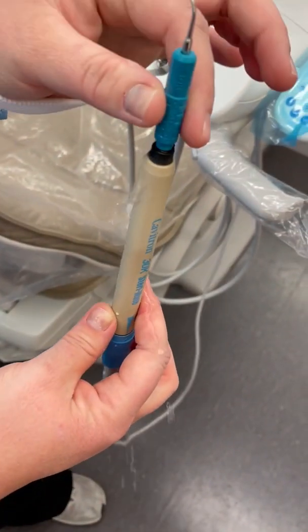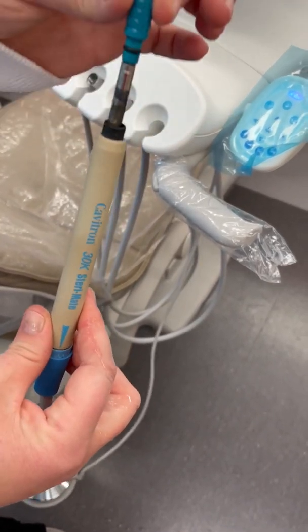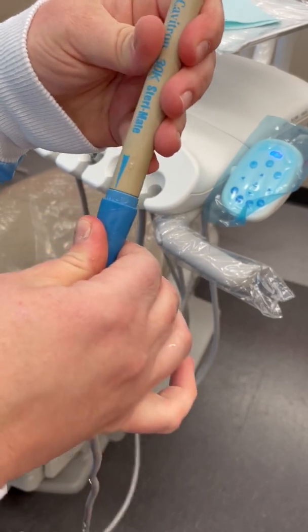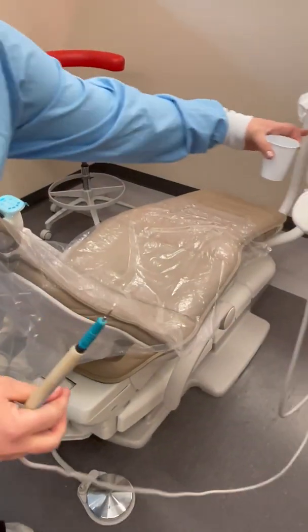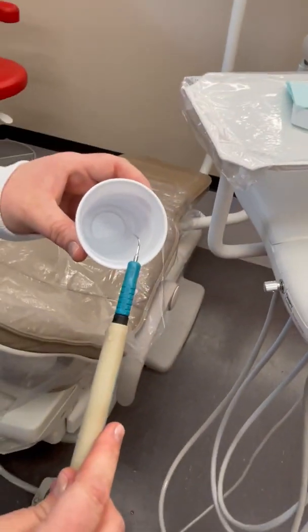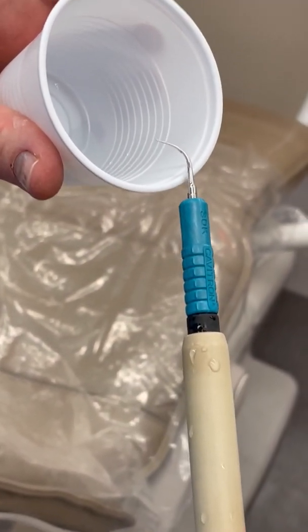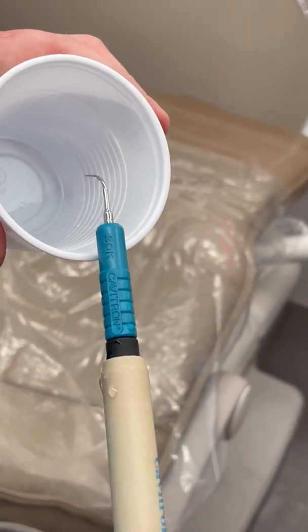Now the water is at the top. You can slip that in there as long as it lubricates this O-ring right here. Turn the water mostly down. The power is all the way down. Give it a pedal — you see it on there, nothing's happening.